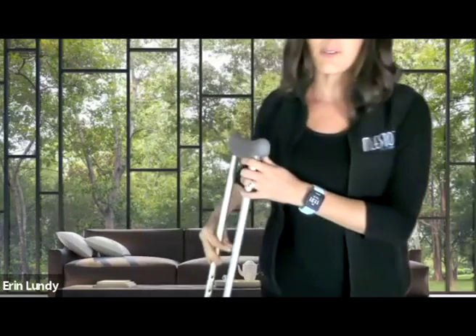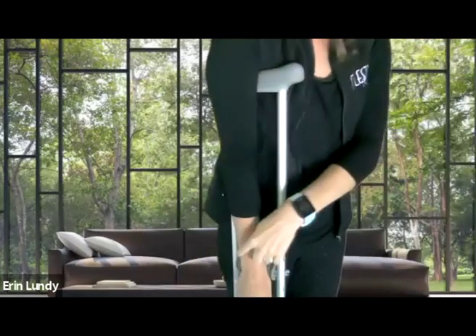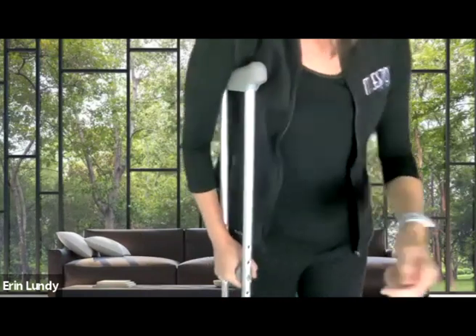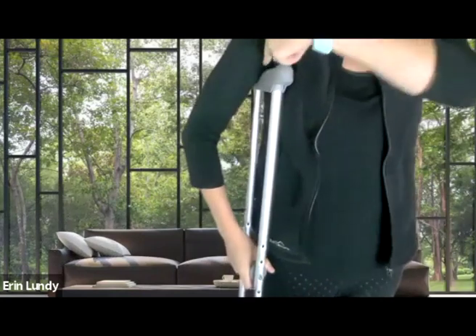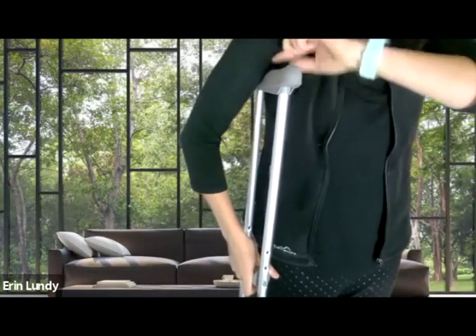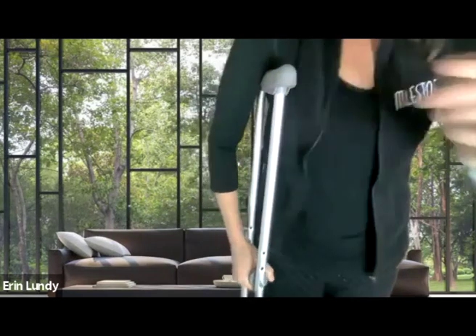As you can see for me, I'm standing right here. The little bump in my wrist is right here, so that's exactly where my handle is going to be. I am resting comfortably here. Also, you should note, I can probably fit maybe 2 to 3 fingers underneath my armpit area to give myself a little bit of breathing room from this top pad. Something to be on the lookout for: if your kid starts complaining about numbness or tingling in these 3 fingers, they're compressing the radial nerve, and they probably need a little bit of a break from the crutches.